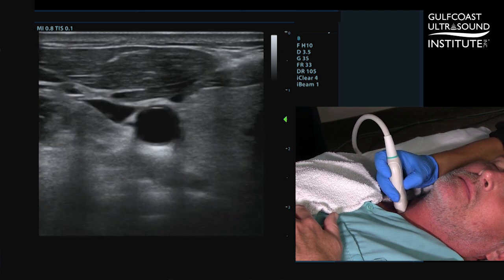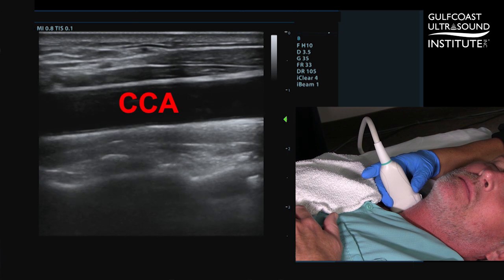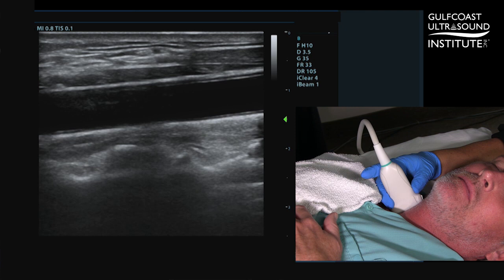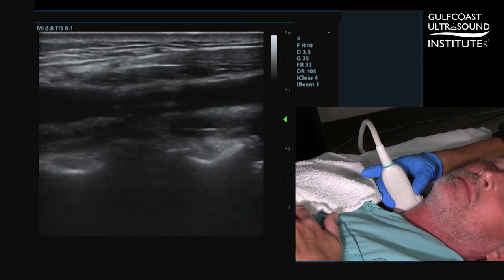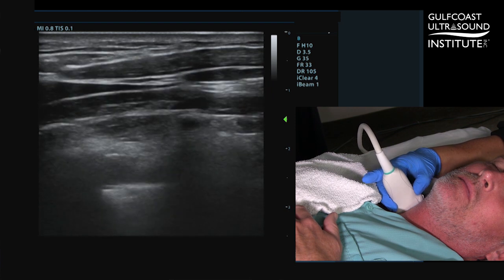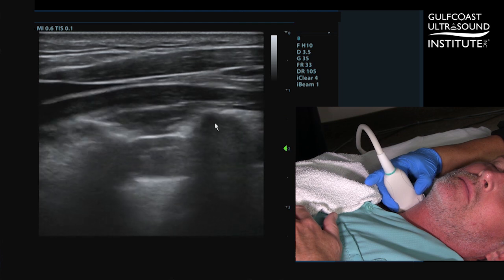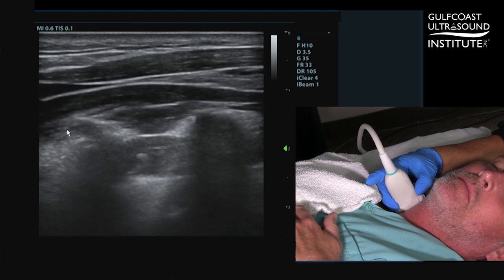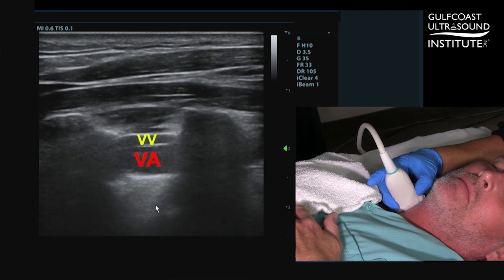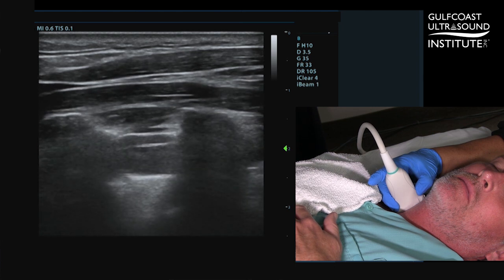The next step is to elongate the common carotid artery and transition into the sagittal or longitudinal plane. Now transition the probe so that you angle the beam posteriorly down through the vertebrae. As you transition posteriorly, you see one vertebra here, one vertebra here, the vertebral artery, and the vertebral vein. The vertebral artery courses in between the transverse foramina of the cervical spine.